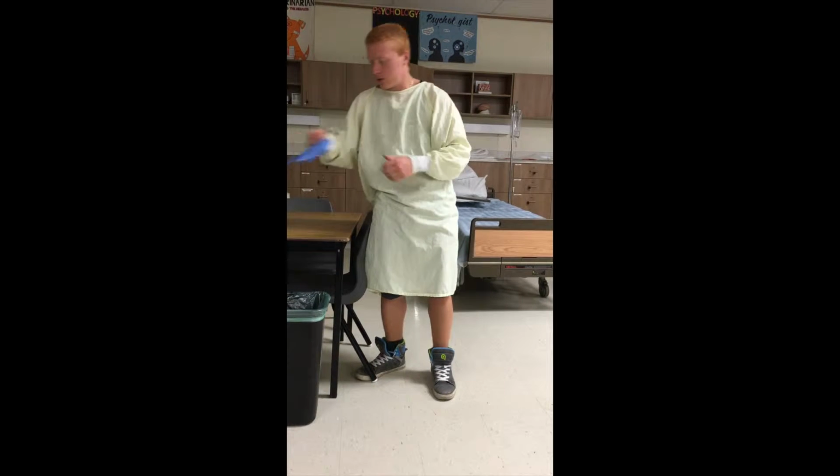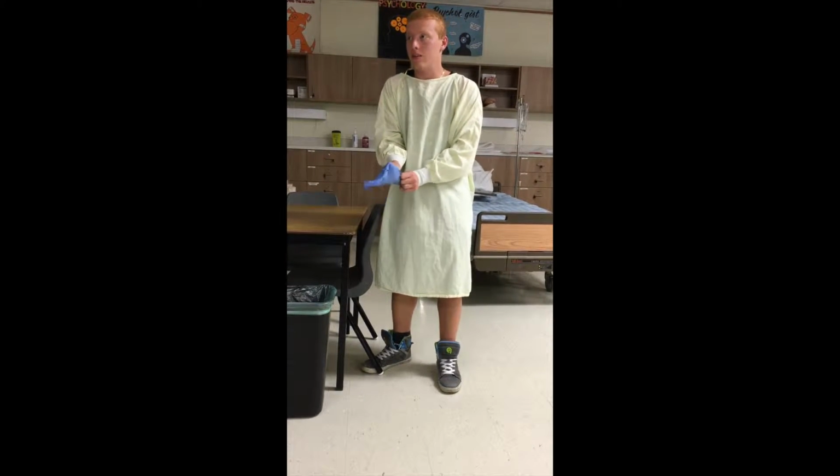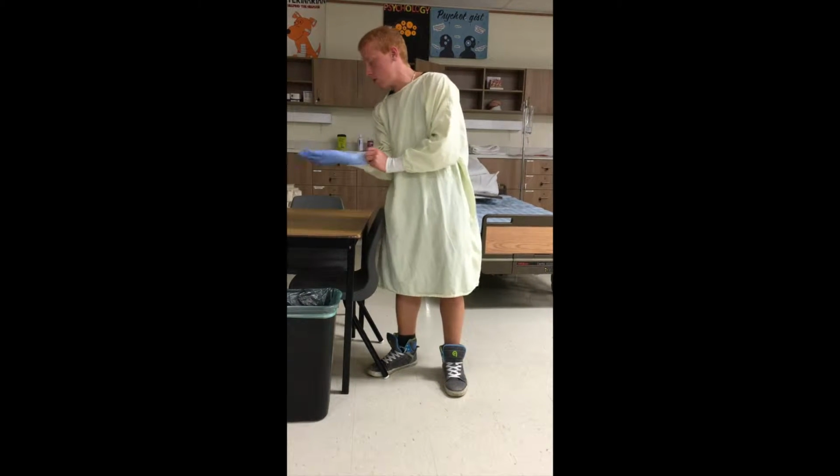Next, you're going to put on your gloves. Make sure they're the right size so they're not too tight, not too loose.